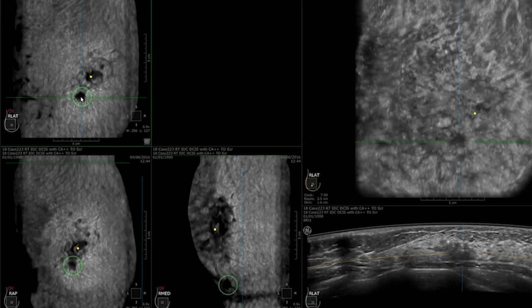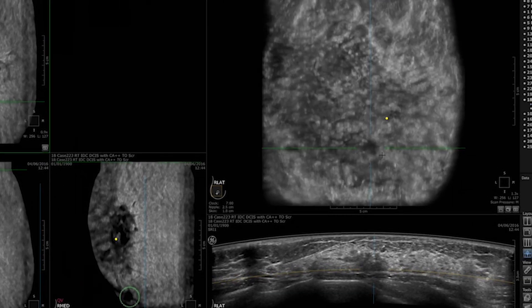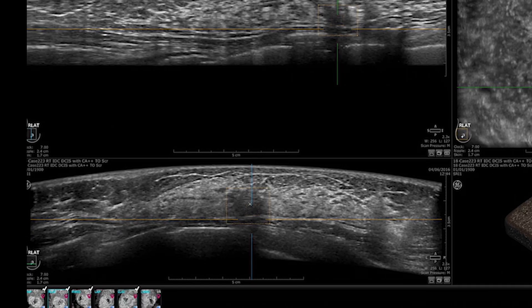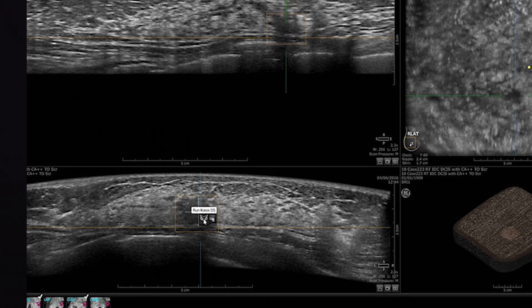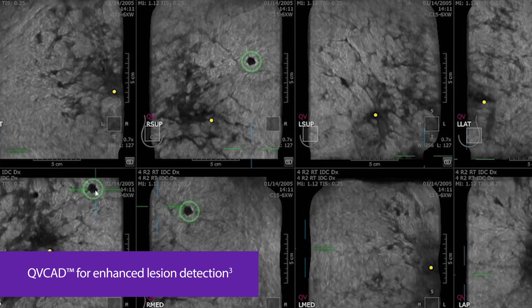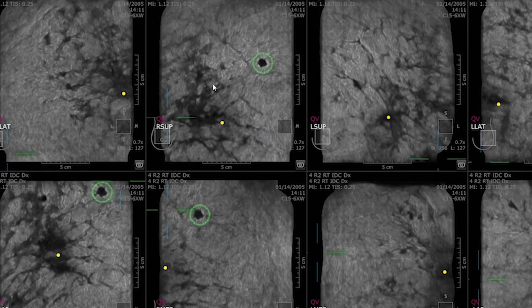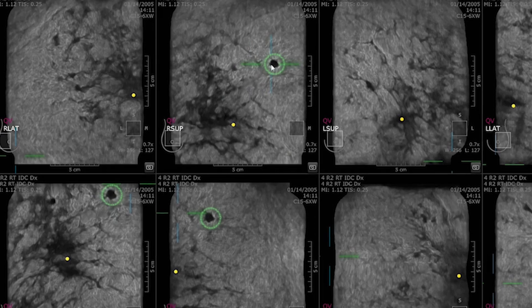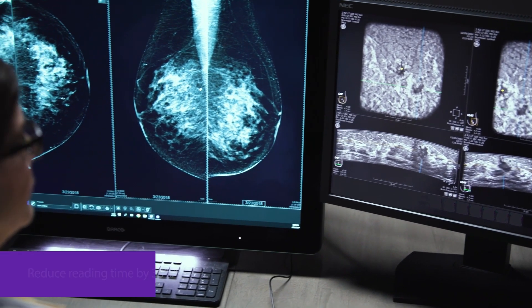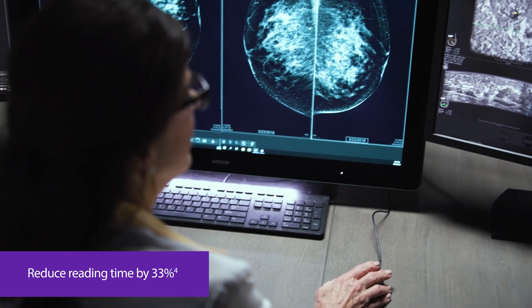The powerful AI assistant seamlessly integrates intelligent algorithms to assist in detecting and characterizing breast lesions. QVCAD displays green CAD markers that highlight areas suspicious of malignancy. The implementation of QVCAD increases reading confidence and helps to streamline the workflow by reducing reading time by 33%.